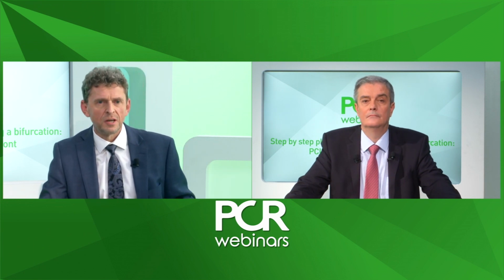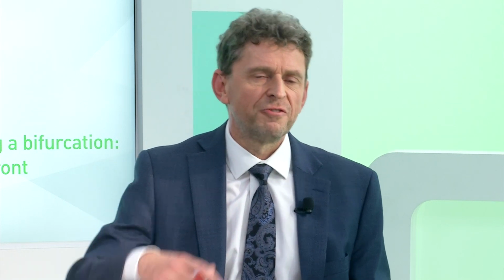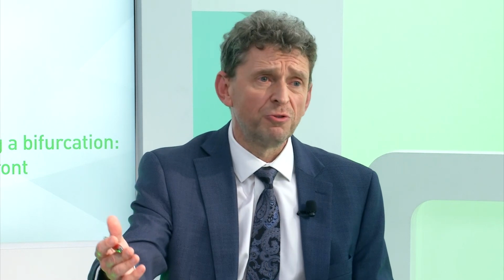Just 1 week ago in provisional stenting, I lost the side branch, fortunately temporarily, so I managed to rescue the side branch. After failure of recrossing through the struts of the stent with a regular wire, I moved to a hydrophilic wire, and it went really smoothly, but unfortunately created a dissection, an extended dissection down the vessel, and to my horror, I saw that the large diagonal disappeared. Yeah? So you have to be very cautious with the stiffer wires.